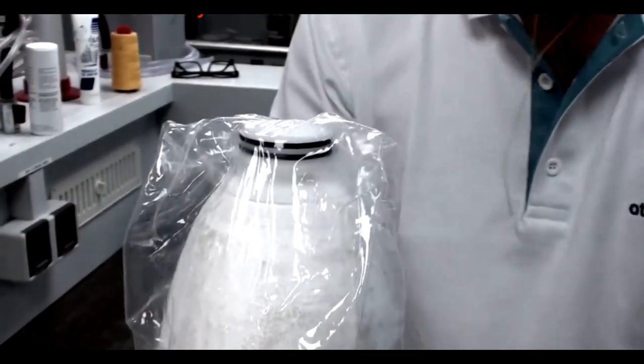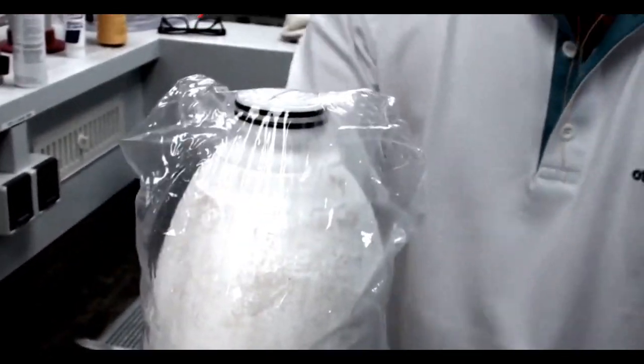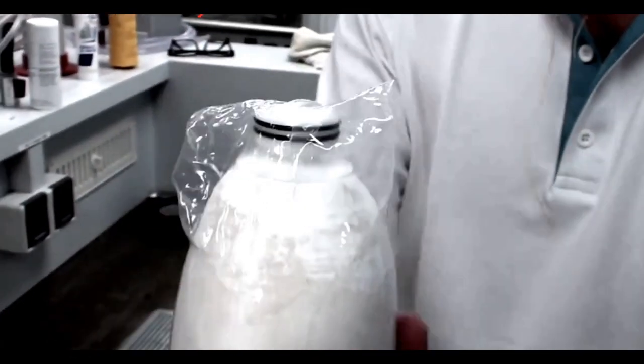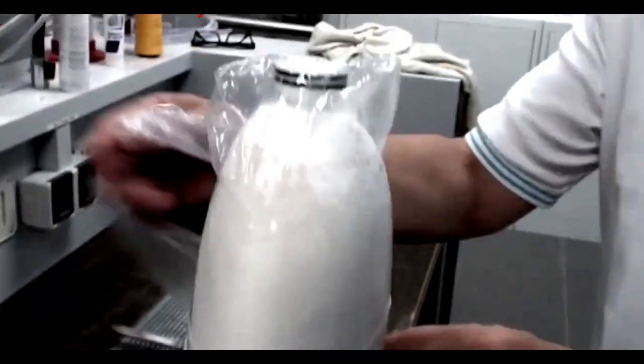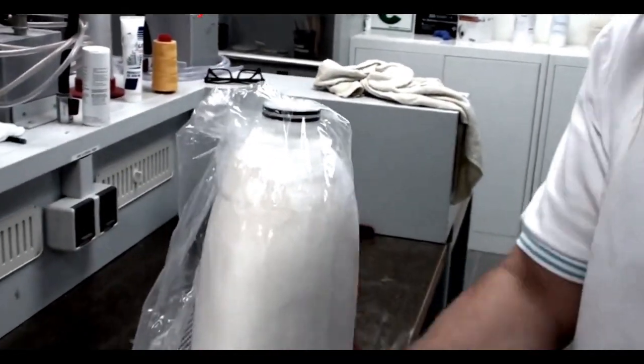At this point we're preparing the positive model for laminating the DVS socket. Prepare a lamination bag as you normally would and stretch it over the positive model.